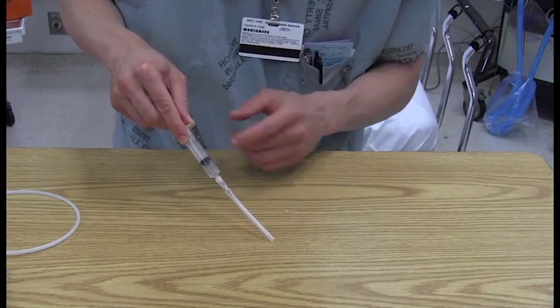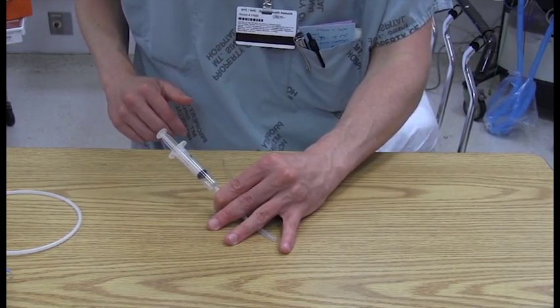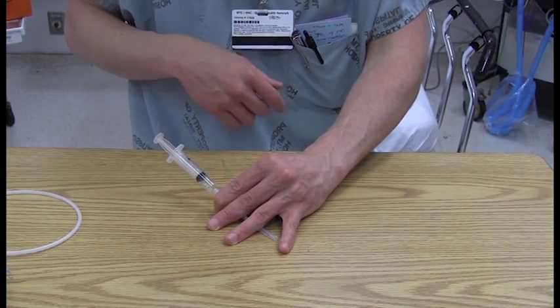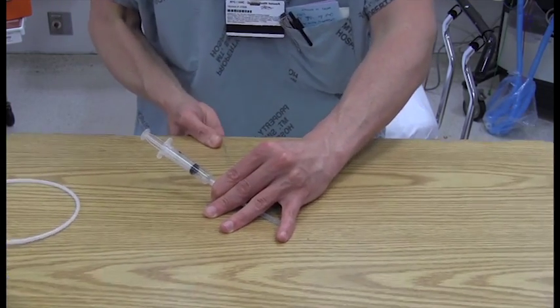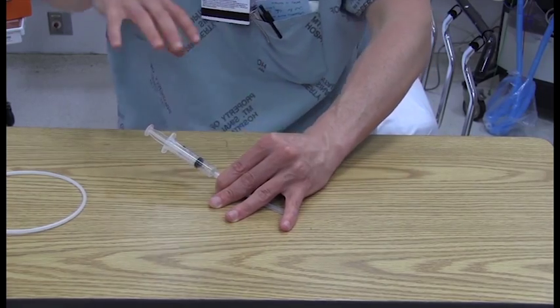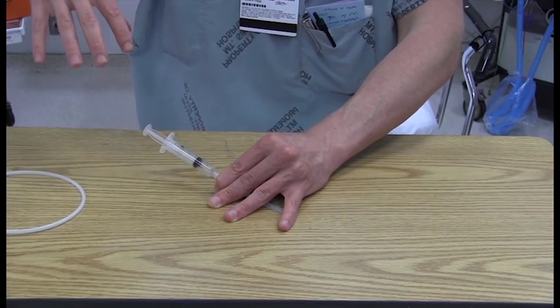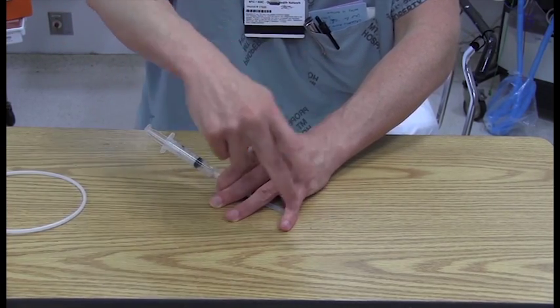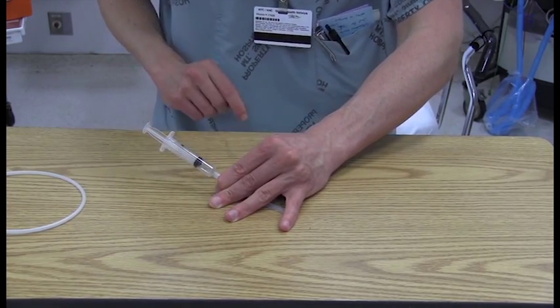So you get in there, you get your flash. What you want to do is, again, place your hypothenar eminence on the patient's body. That's the equivalent of the pool table felt. And what that's going to do is a few things. It gives you a stable base. Also, if the patient moves while you're trying to do this procedure, your hand is now a part of their body, and the hub of the needle will stay in its stable position even as the patient moves back and forth. So hypothenar eminence touching, I spread out these three fingers and I grab the needle between my thumb and my index finger.